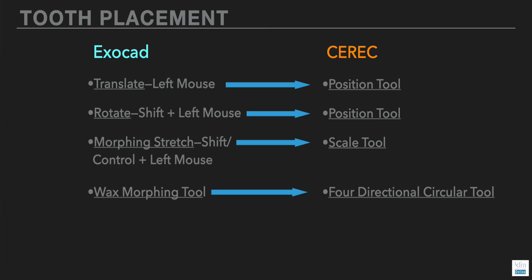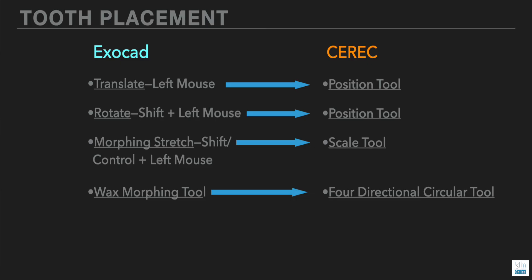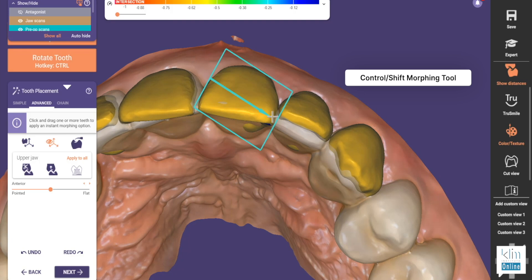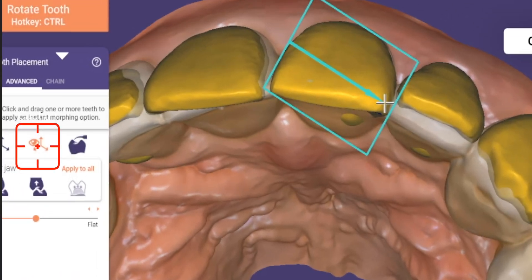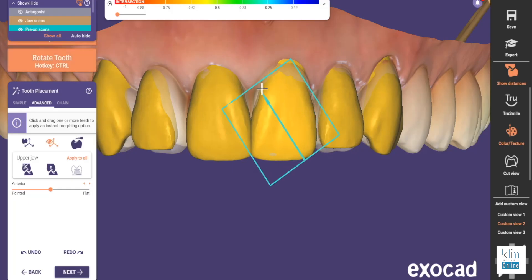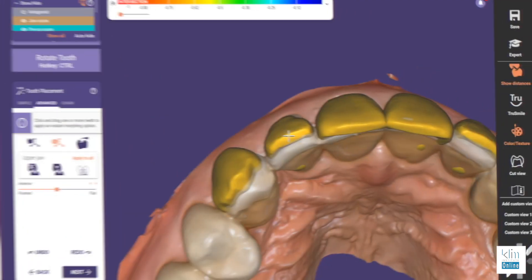You're going to find several tools there that are really important. In CEREC we have the position tool and the scale tool — believe it or not, that's pretty much my major tool I use in the tooth placement screen in Exocad. Now there's one additional tool that's just magical, similar to the circular four-direction tool but so much better — it's the morphing stretch tool. But in order to access that, you use Control-Shift, but you have to be in the icon with the little eyeball on it. With that, you can stretch and morph that tool so it really fits the arch well during a wax-up.